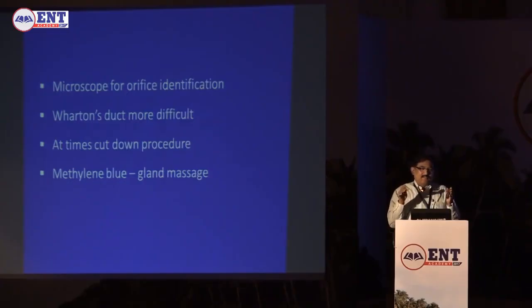But in salivary endoscopy, the whole gland is soft. There is nothing rigid. So it is like your nose floating in water. So you have to have that gentle feel, and all the time, just like gastroenterologists, you know why gastroenterologists never touch the cricopharynx for biopsies? Any of you thought of it? They'll do biopsies anytime below the cricopharynx. But the cricopharynx, they can't. It's a blind area for them because your gastroendoscope requires air to dilate the viscera before it can see. And at the cricopharynx, it is just after entering the cricopharynx only that it will dilate.